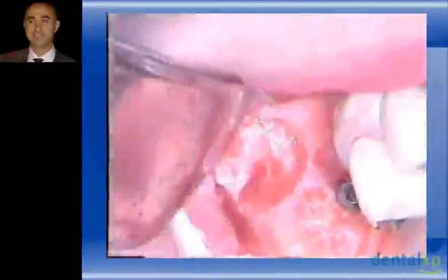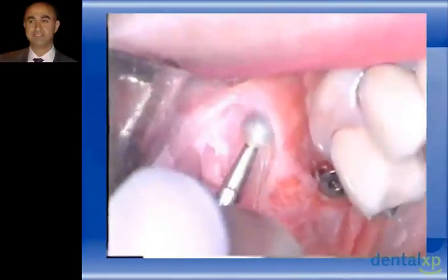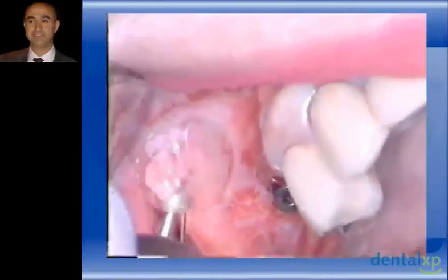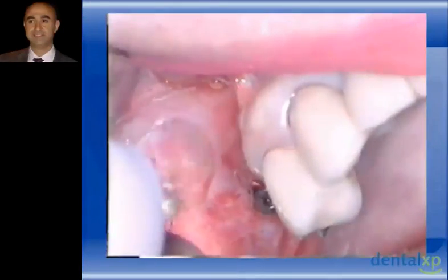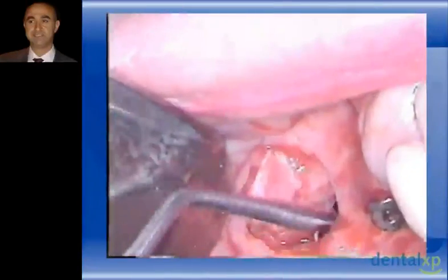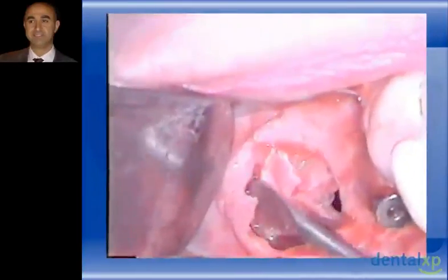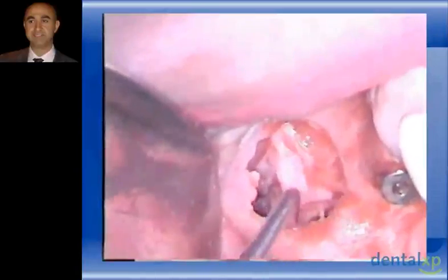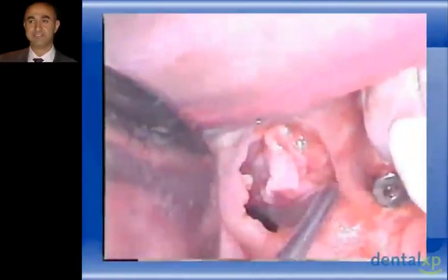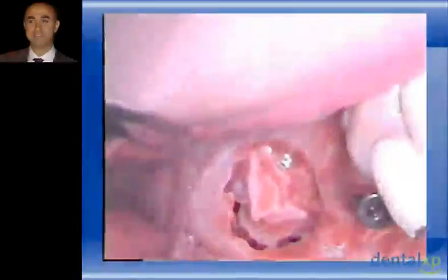You can see the amount of fibrous tissue which was generated on the ruptured Schneiderian membrane. You can see that some bone has been regenerated from the previous open lateral window. Again, the whole idea is to show that the complications that can occur during this very technique-sensitive procedure can be overcome if you know what you're doing. But the most important thing after this is the right loading of the case and knowing the right biomechanical principles of loading. In the same case, after re-elevating, you can see 1, 2, and 3 perforations. But when we have perforations, we all know there is no problem; after elevating we can just place a collagen membrane inside to fix the perforation.